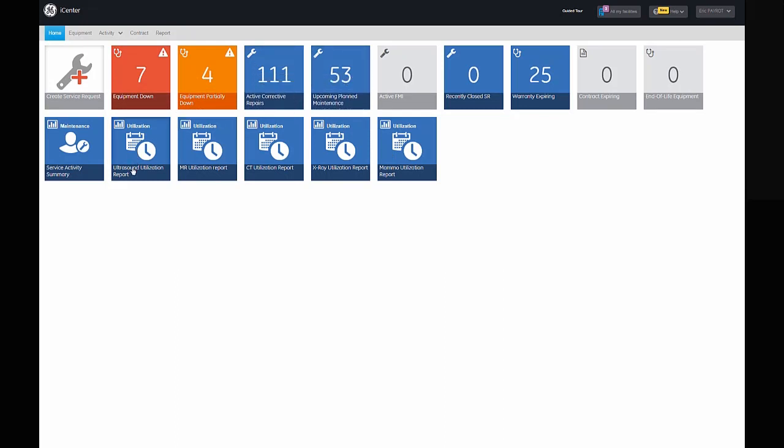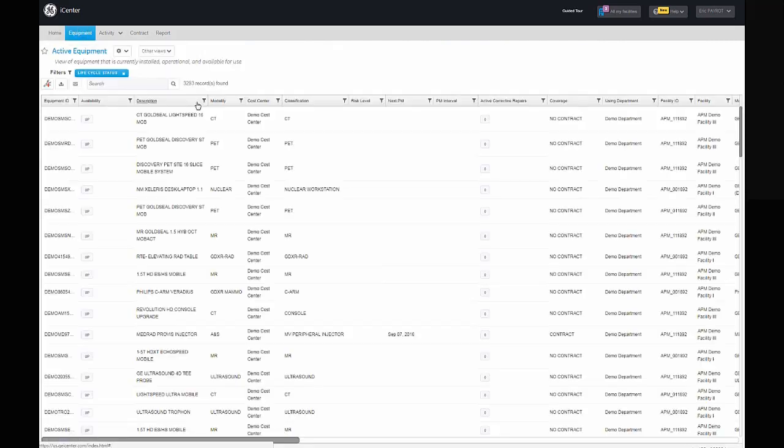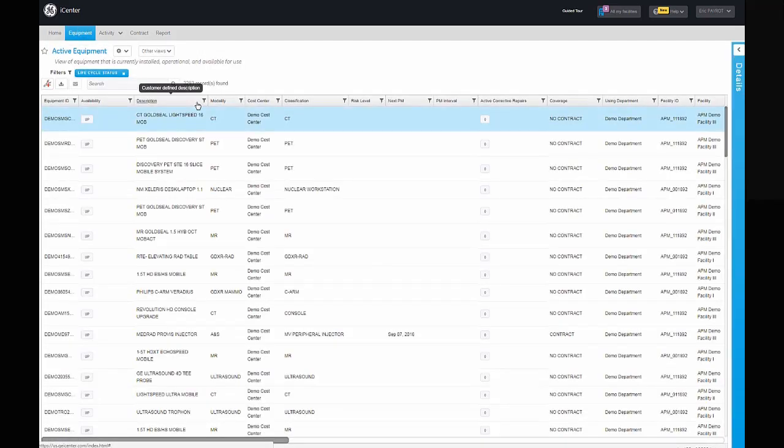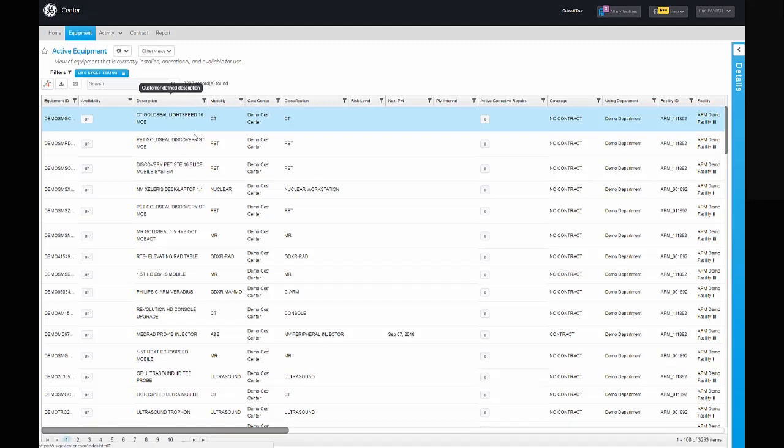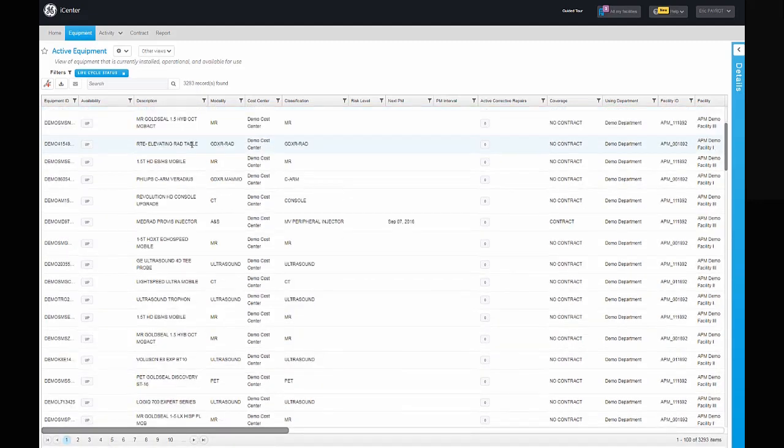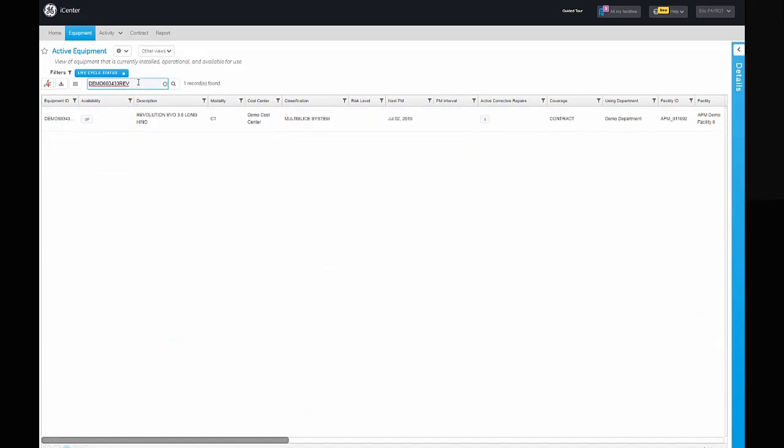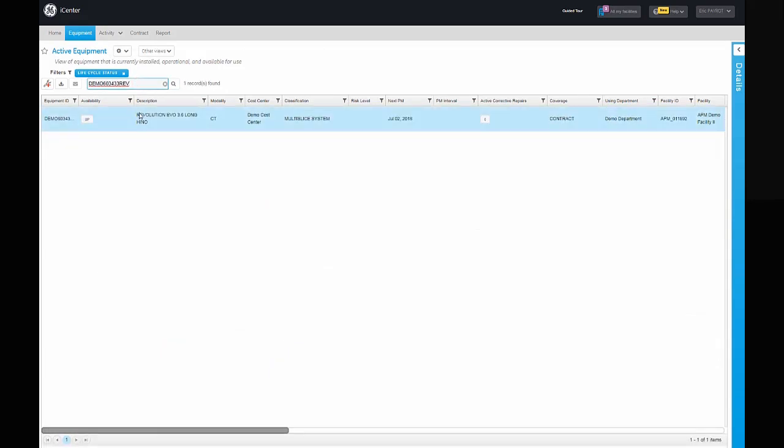The equipment grid view provides a comprehensive list of GE inventory and details about each asset. While in the grid view, you can search for specific equipment and click on the search result to access its details.